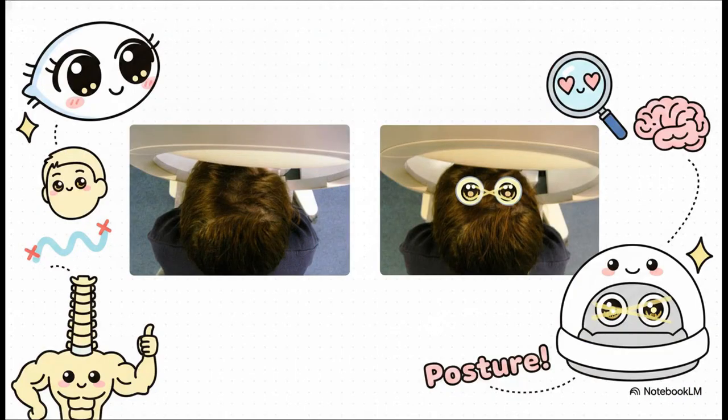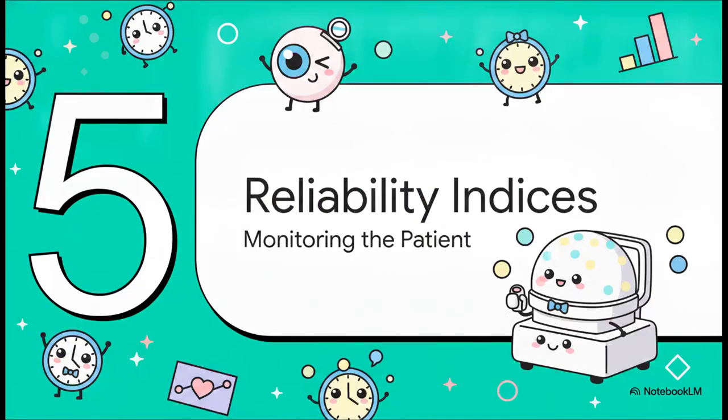Another super easy mistake comes down to patient posture. You really must ensure the lateral plane of the perimeter is completely consistent with the line of their head. If their head is turned or tilted even a little bit, you risk artificially inducing visual field defects simply because the bridge of their nose or their brow bone is physically blocking the stimulus. Posture absolutely matters.